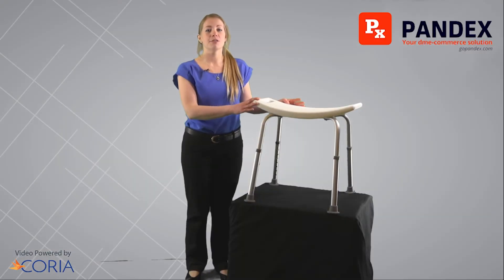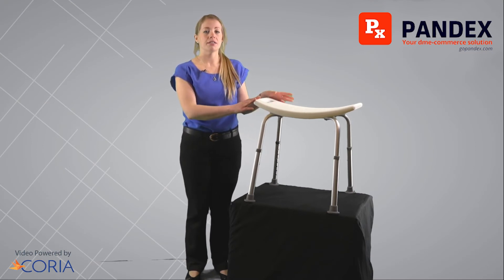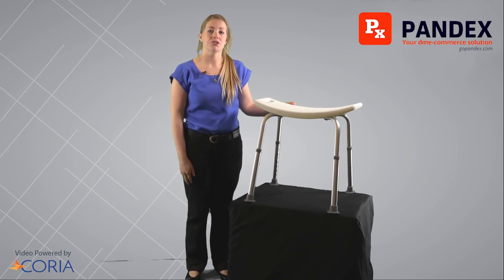Cleaning your shower chair is simple — you can just wipe it down with a wet cloth. This particular shower chair is our standard shower chair, and it does also come in a bariatric version.